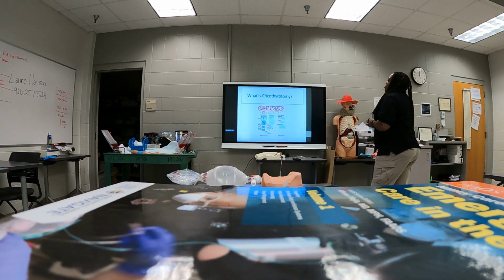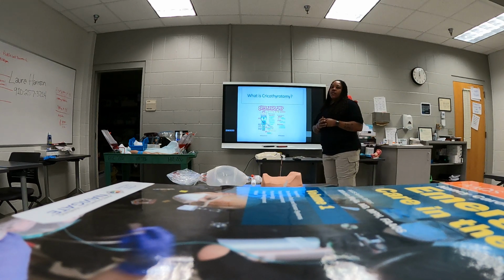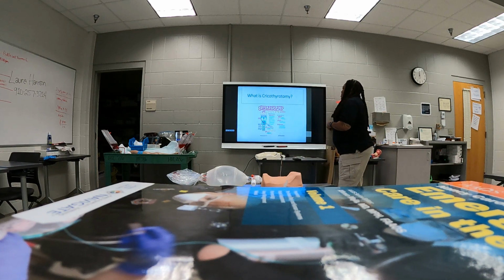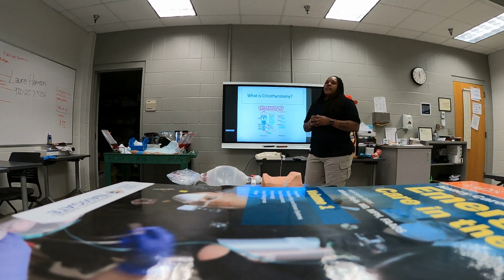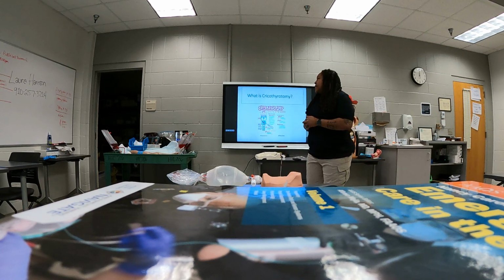We're going to start off with what is cricothyrotomy, right? It's a big fancy word, and when you look at it, what is it? Basically it is an emergency airway intervention that can be performed by ALS providers, and paramedics are one of those, which you guys are learning to be, paramedics.